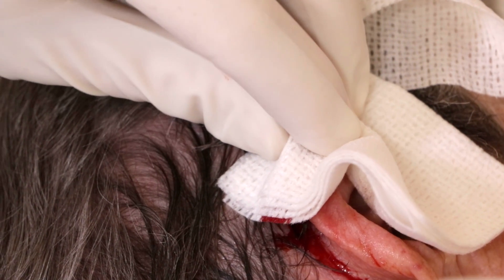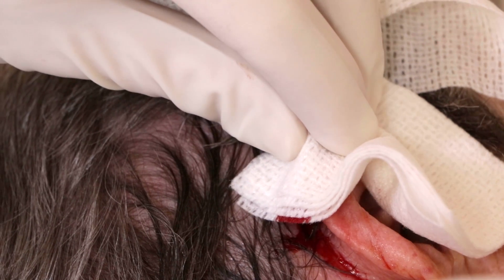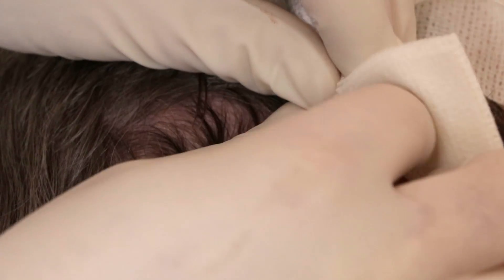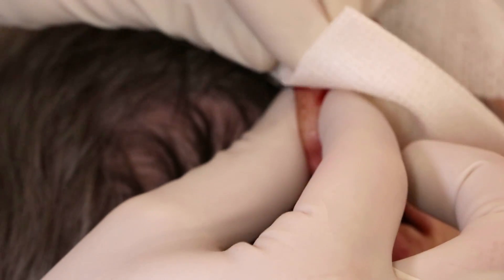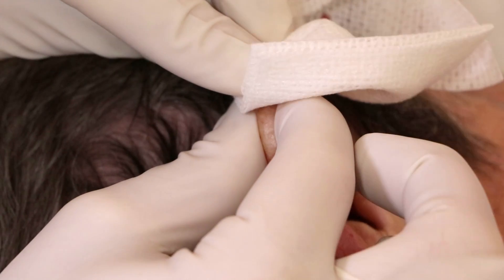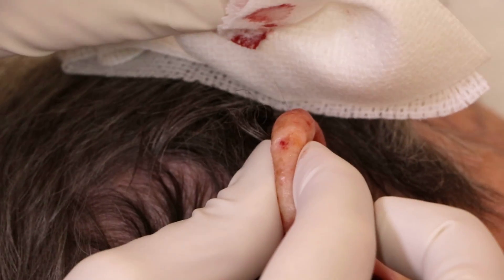For the wound seal, to get ready for it, I'm going to be pinching the ear down here. See how that makes the bleeding stop?